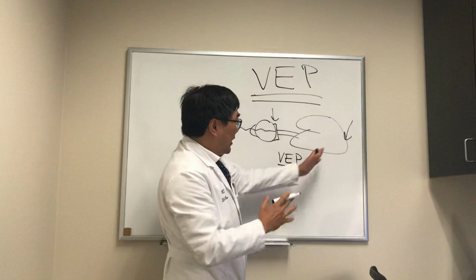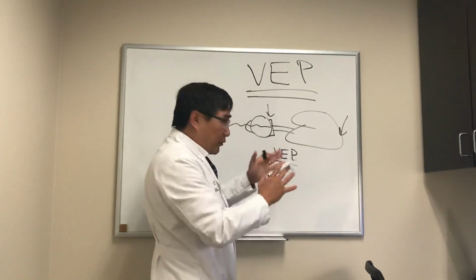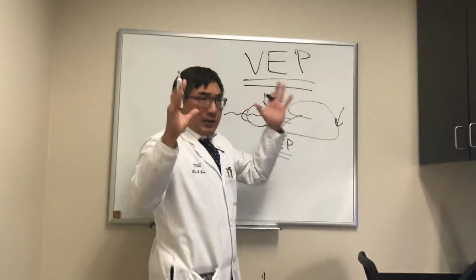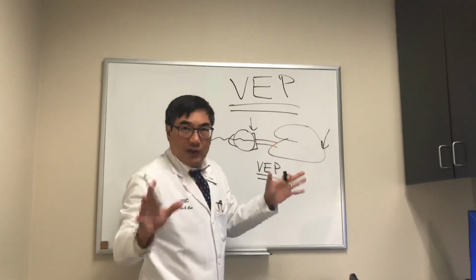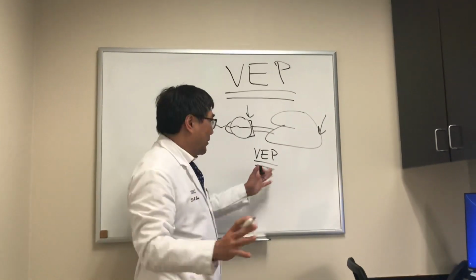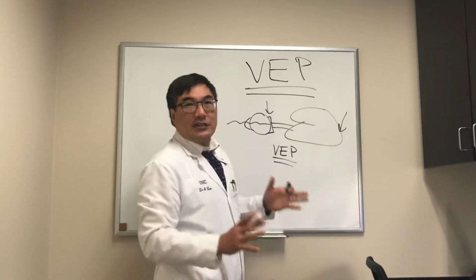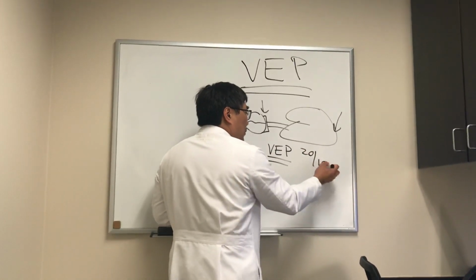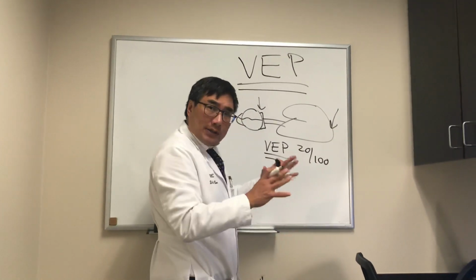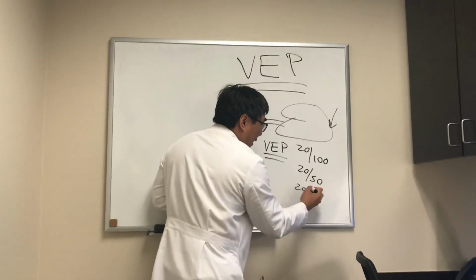And as you know, most of the visual evoked potentials actually are macula. So when we're measuring the VEP, it's really measuring a lot of the central vision. We're not really going to use it for testing visual fields, for example. So if someone has homonymous hemianopsia, their VEP might be totally normal because you're only measuring the center part of their vision.